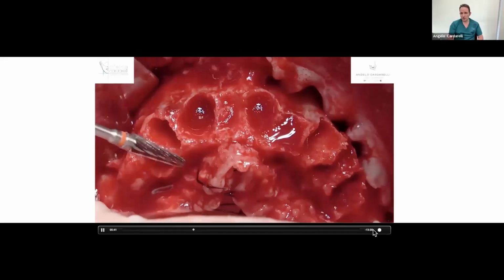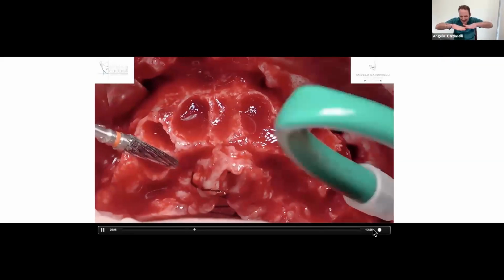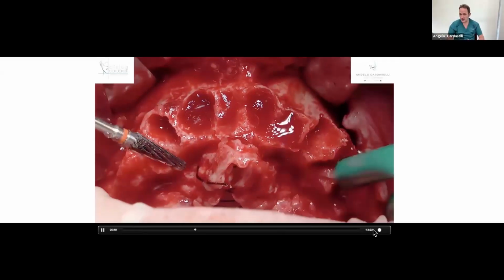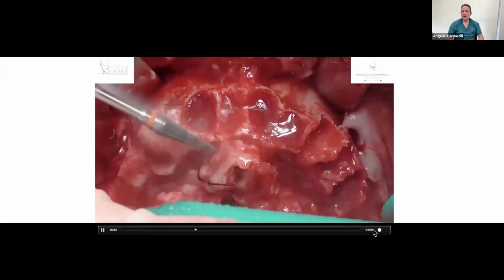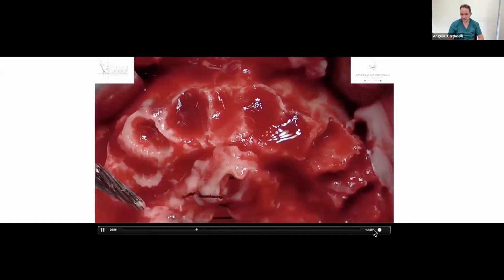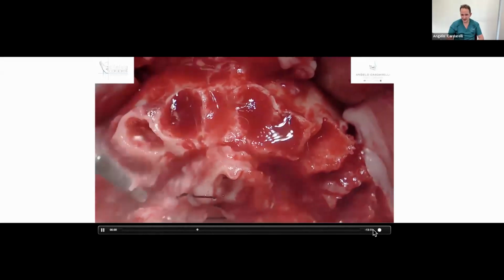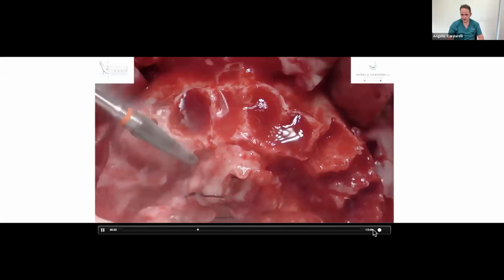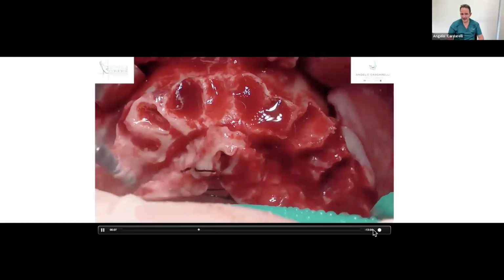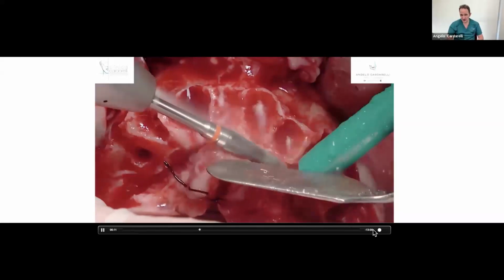After that, we need to make the bone reduction, because we need to place the implants at the same level, okay? And you can use the piezosurgery procedure, or you can use the burs to remove the bone in order to have the same bone level, exactly like this, okay? Here we don't have a problem in terms of the thickness, we have a problem in terms of the height, because in the posterior we have the sinus, okay?